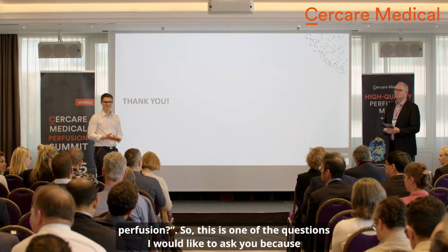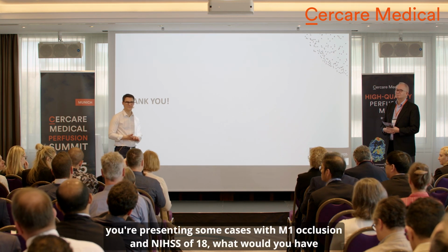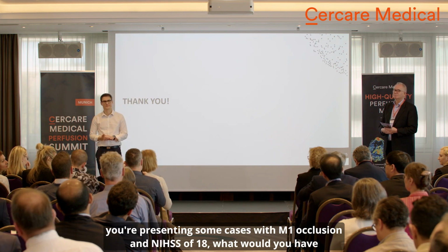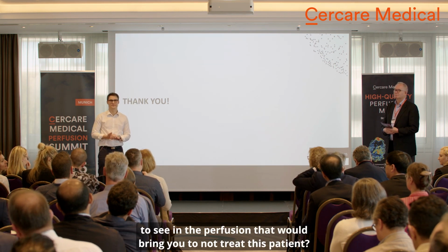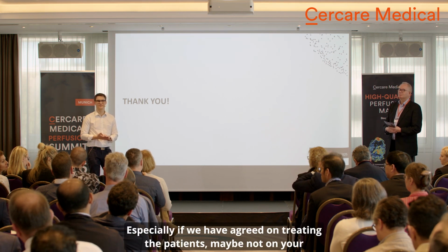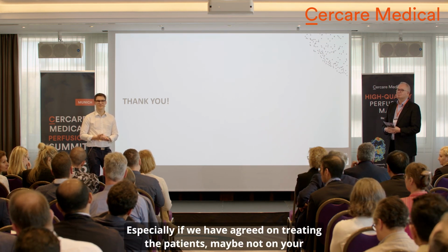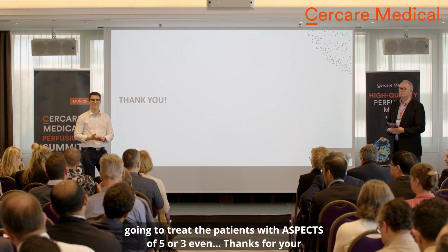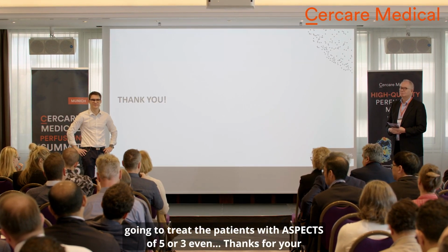So this is one of the questions I would like to ask you, because you're presenting some cases with M1 occlusion and NIHSS 18. What would you have to see in the perfusion that would bring you to not treat this patient, especially if we have agreed on treating the patients, maybe not in your institution, I'm not sure, but commonly after the last year's trials, that we are going to treat the patients with ASPECTS of 5 or 3 even?